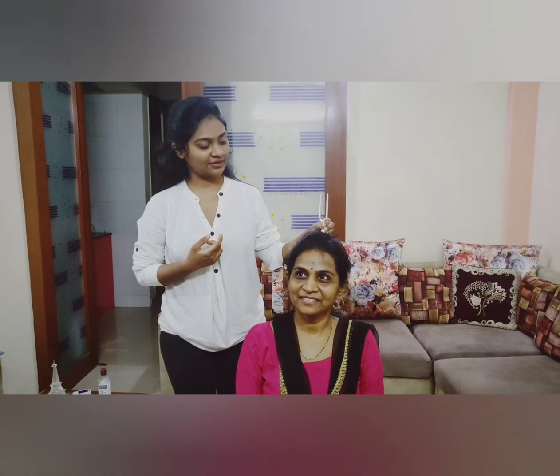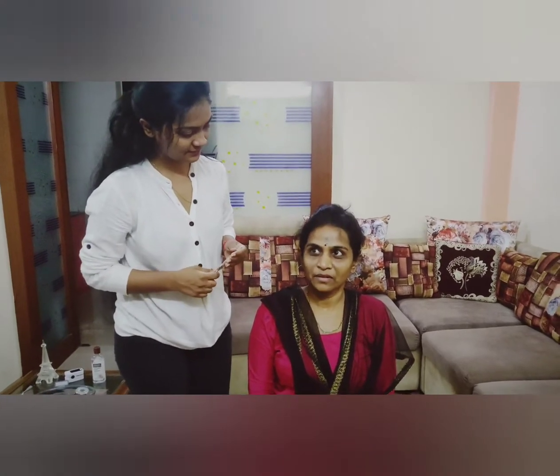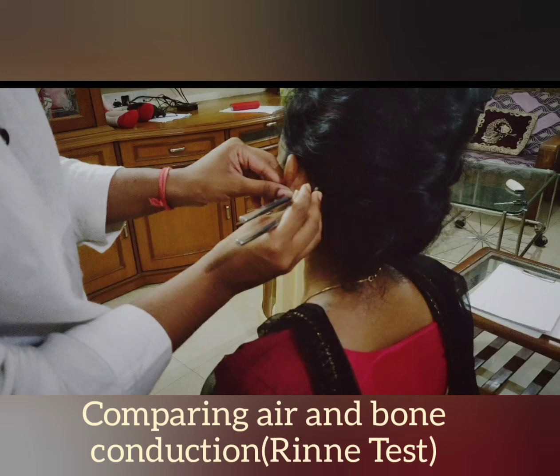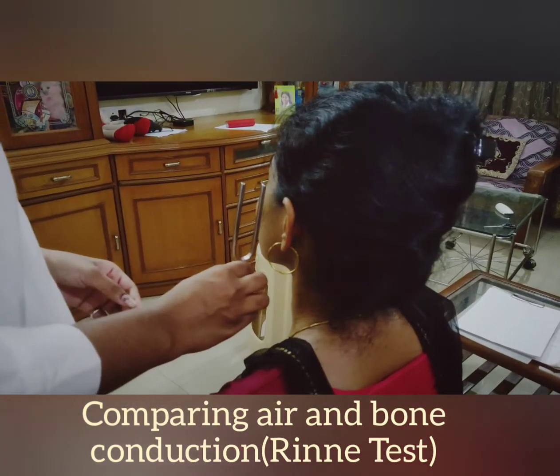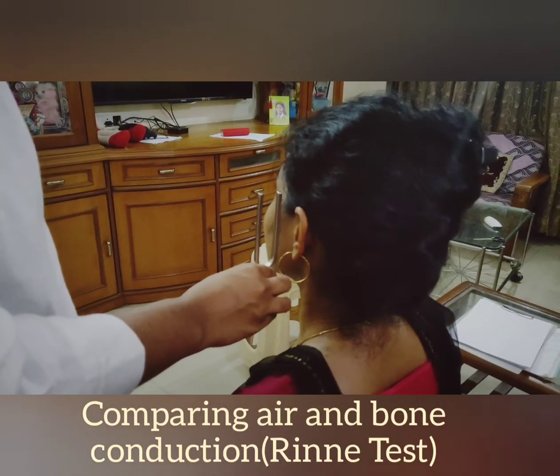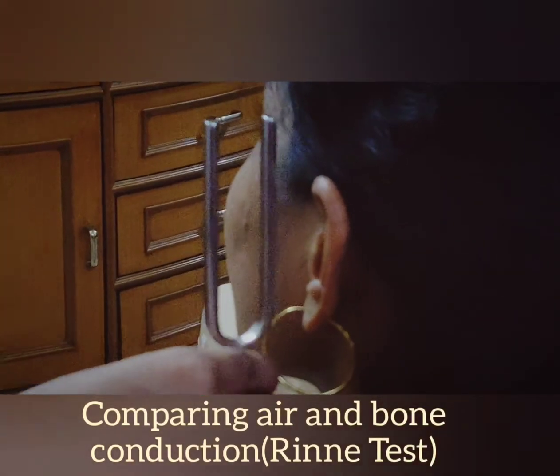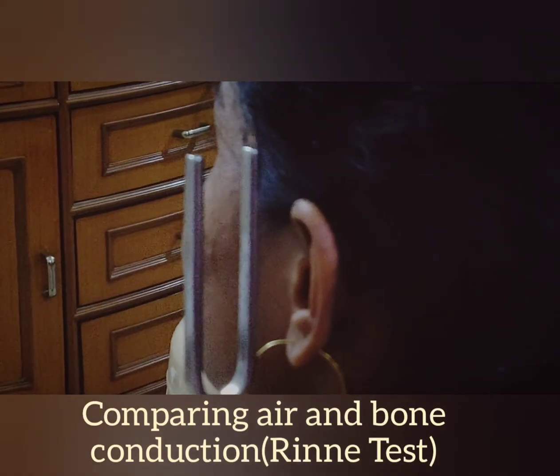Both ears. Okay. Compare air and bone conduction by performing Rinne test. Place the base of the lightly vibrating tuning fork on the mastoid bone behind the ear and level with the canal. When the patient can no longer hear the sound, quickly place the fork closer to the ear canal and ask if the patient hears a vibration. Here, the U of the fork should be placed forward, which maximizes sound transmission for the patient.